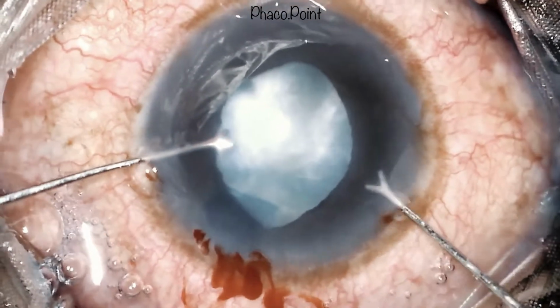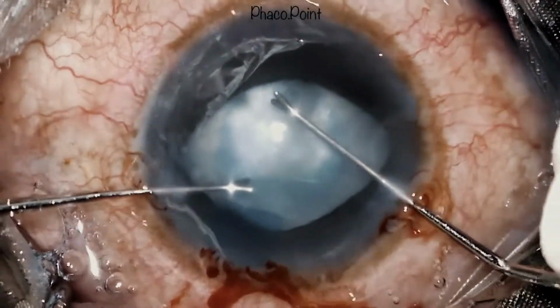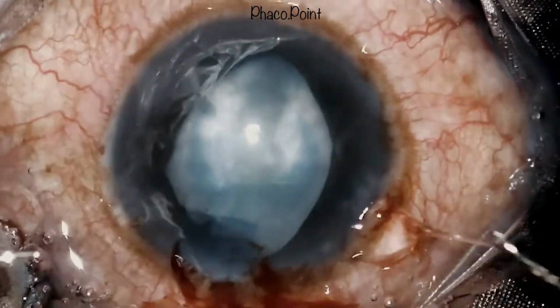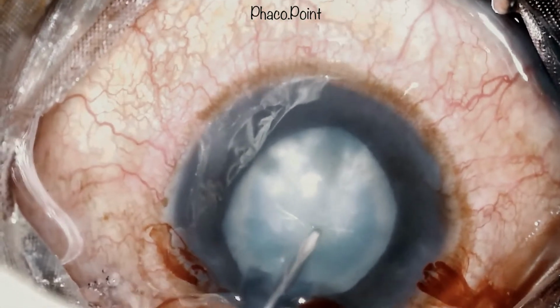As you can see, I then introduce two Y-shaped hooks through the side port incisions and attempt to create a pupillary stretch. As you can see, at the end of the pupillary stretch in two directions, I have a fairly large pupil. We then proceed to performing the capsular rhexis.